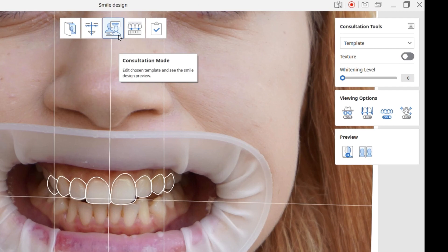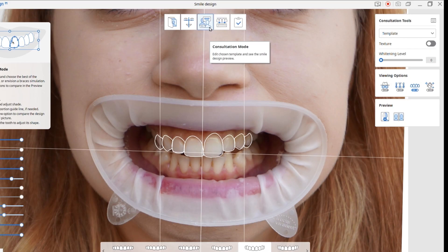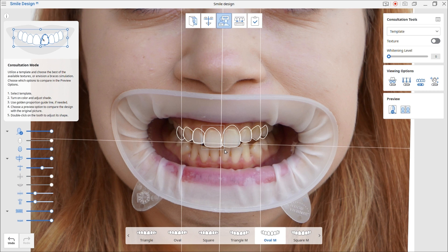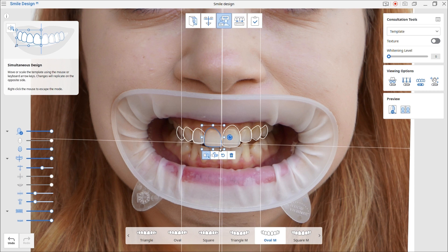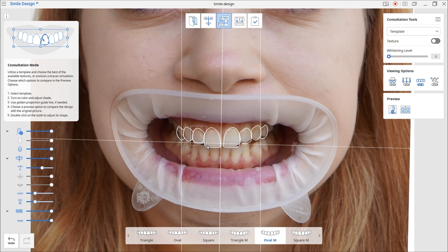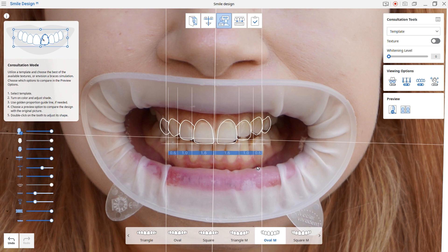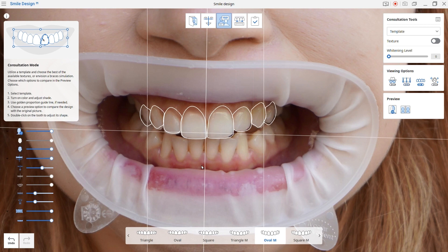First is Template. Select the teeth template you want — the teeth shape you choose will be displayed onto the image. You can modify the individual tooth template's scale, size, and location, or drag to select several and modify them all together at once. Click on a tooth template to adjust its size and location. The options that pop up include simultaneous design and mirroring, which help you easily apply changes to the opposite side. You can also turn on or hide the golden ratio reference, and double-click the tooth template to make more precise changes to its shape.